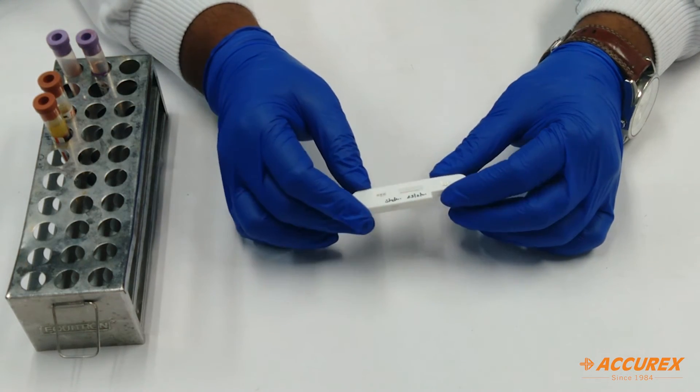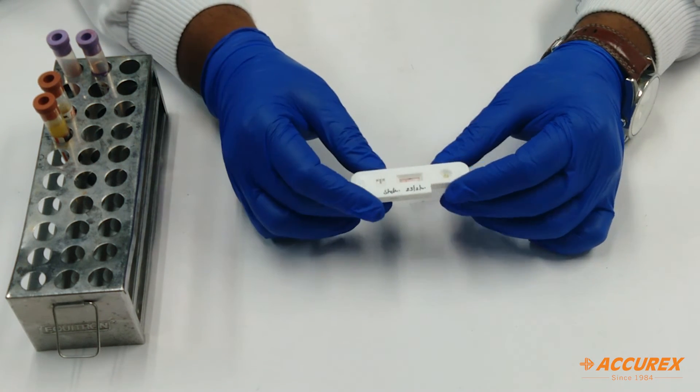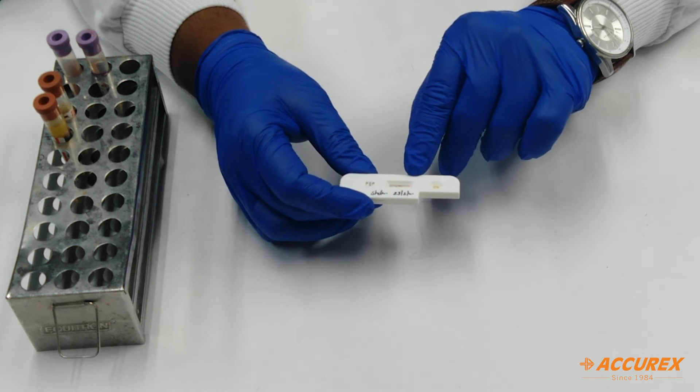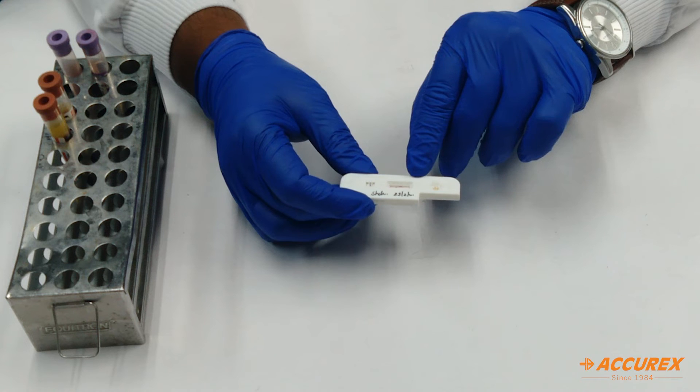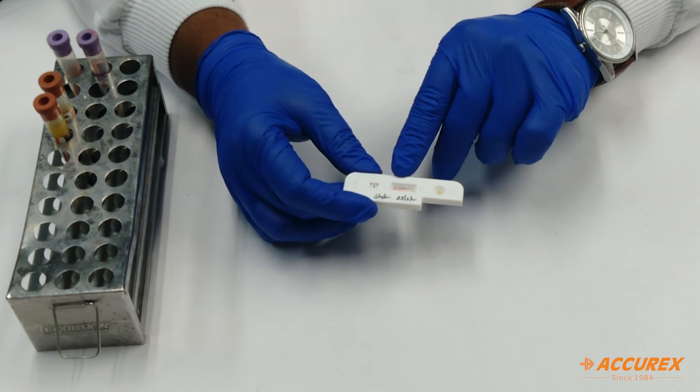You can see the line has developed near the control line. This means the test is negative, and there is no line developed near the test line. If there is a test line, it means it is a positive result. Since only one line has developed near control, the test is negative.